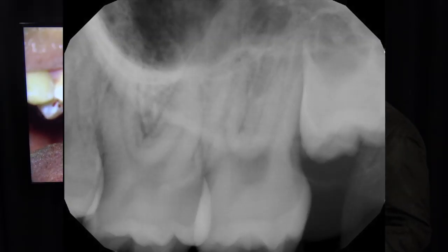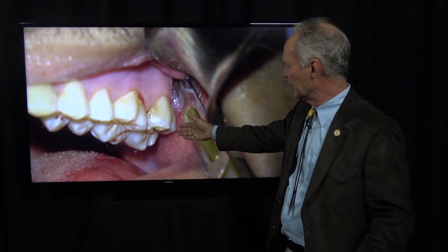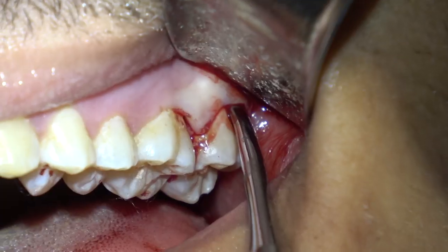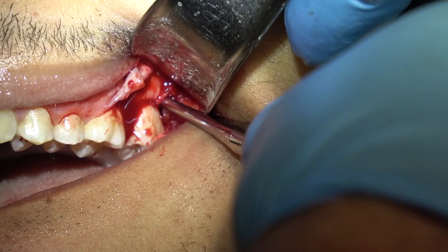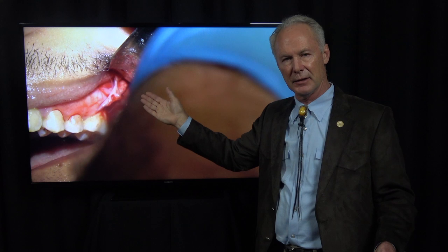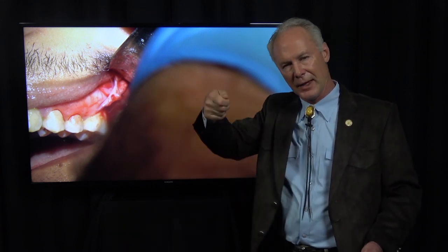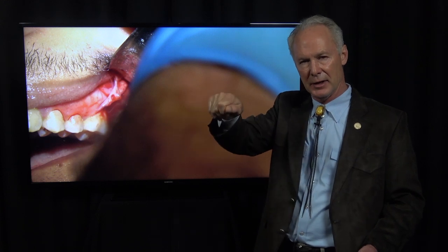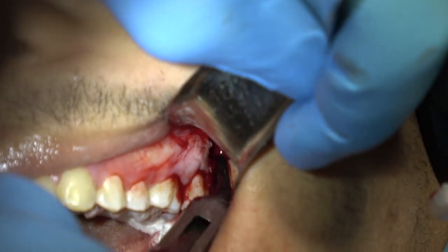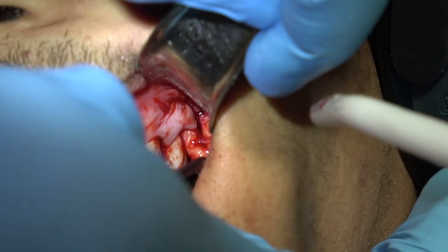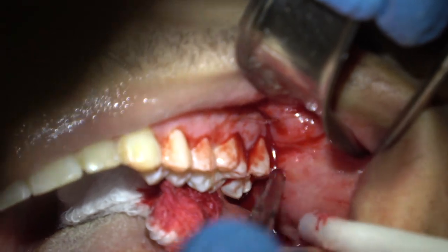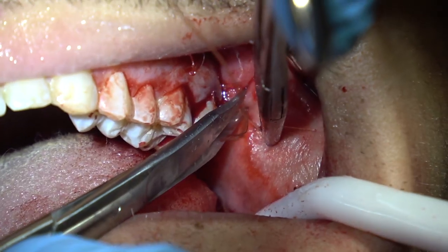Here's the upper left wisdom tooth — same things we did on the right side. A vertical incision down to the non-attached, non-keratinized gingiva, then an incision around the distal of the second molar. Slipping the periosteal elevator first between the impacted wisdom tooth and the distal of the second molar, elevating first with the periosteal elevator, then the 301 elevator. I've got the 2x2 in the back of the mouth to protect the airway. Then remove the follicular sac with rongiers and place one 3-0 gut suture.